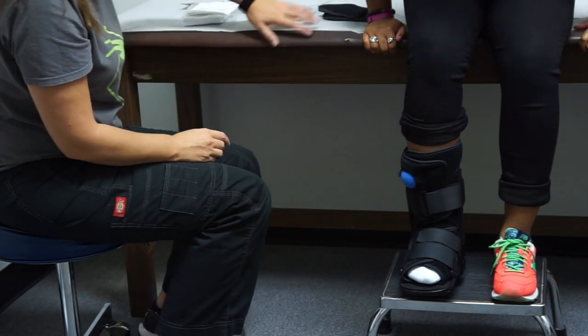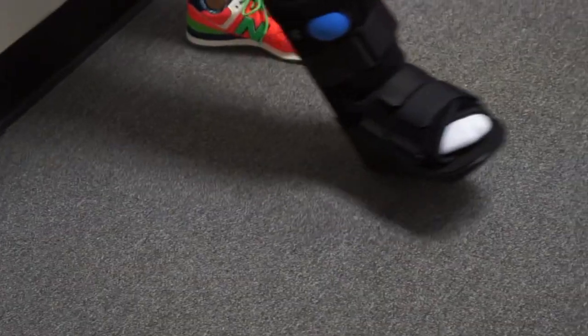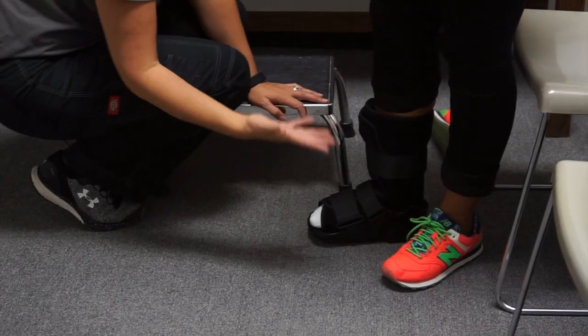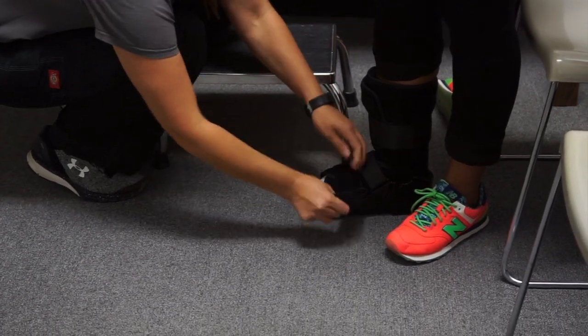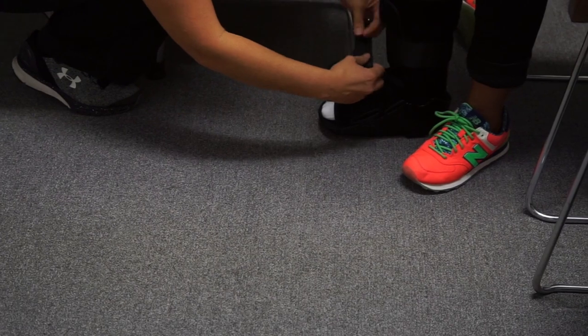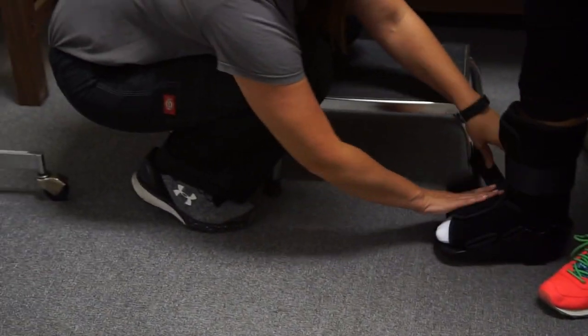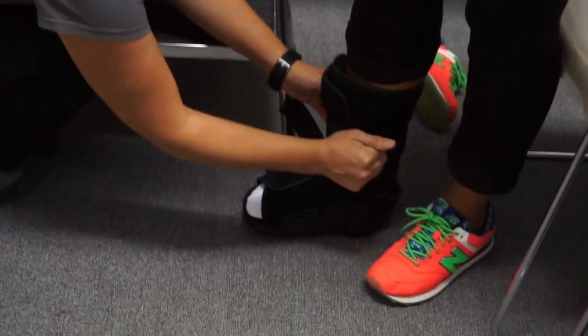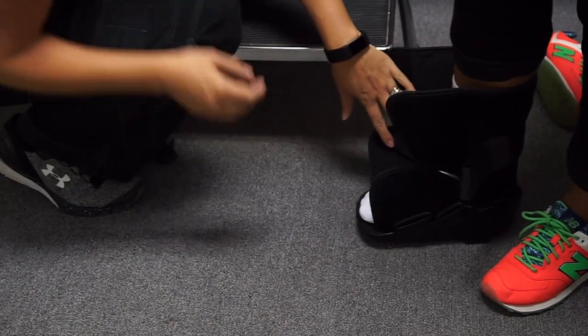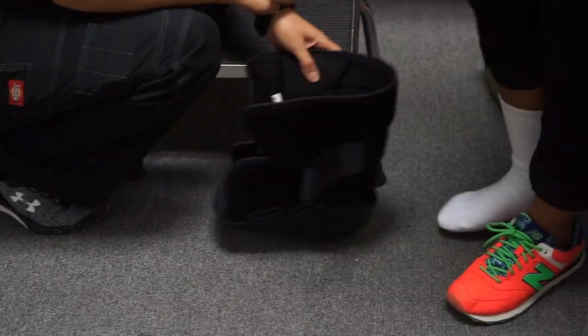To remove it, simply pull each strap off, remembering to fold the velcro back on itself to maintain the life of the velcro. Then the foot pops right out — and there you go, all better.